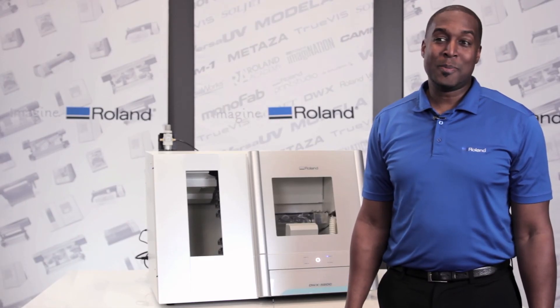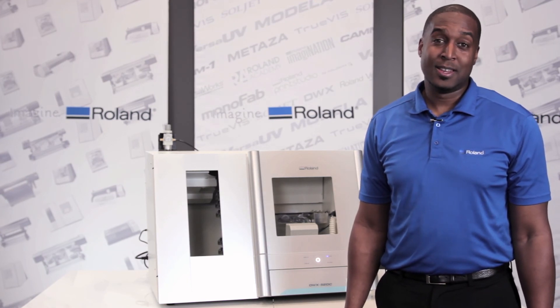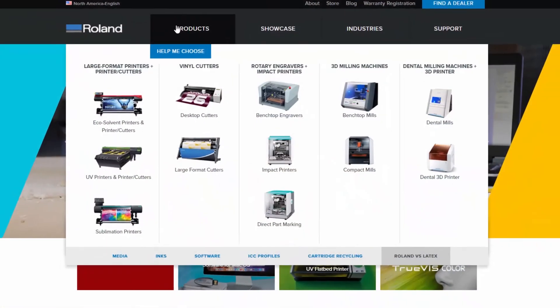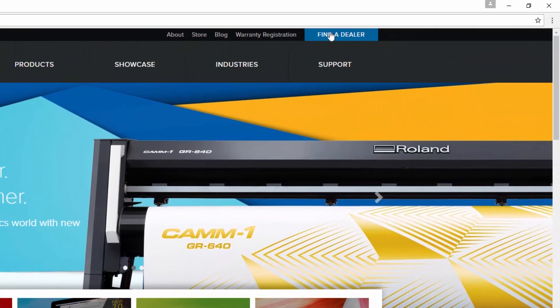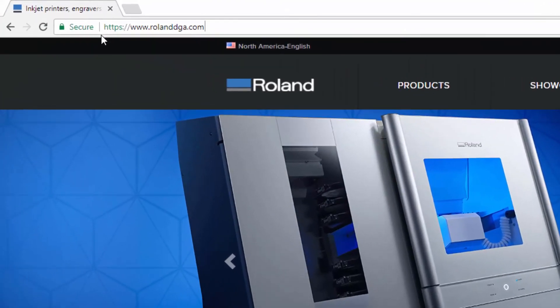These features and more make the DWX52DC the perfect solution for your lab's needs. It works day and night, so you don't have to. To learn more about the DWX52DC or find an authorized Roland dealer, visit our website at RolandDGA.com.